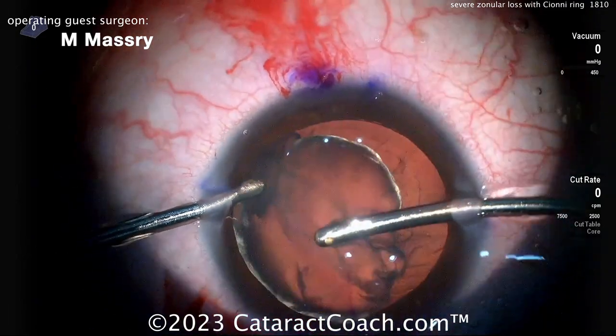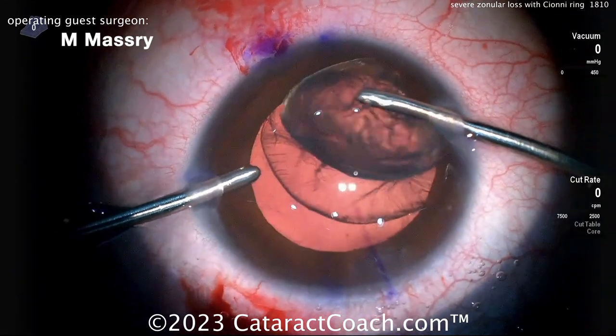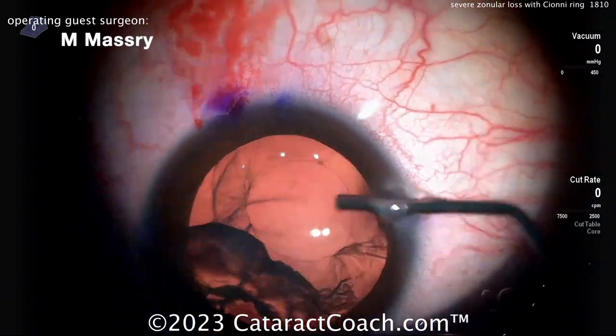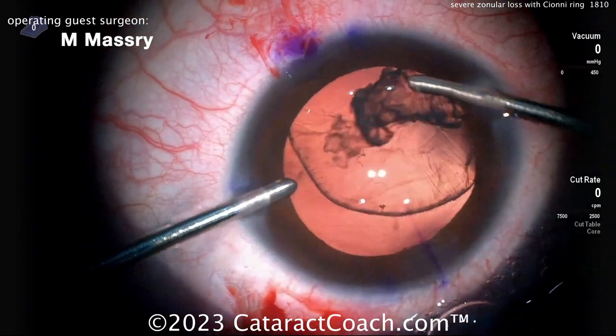A little hydrodissection — the lens is very soft, bringing it up out of the capsular bag. That can be aspirated just with the IA probe. It's obviously a very young patient with severe subluxation. That comes out nice and easy. Be careful — the capsular bag is very floppy. I like the idea of using viscoelastic here — smart.